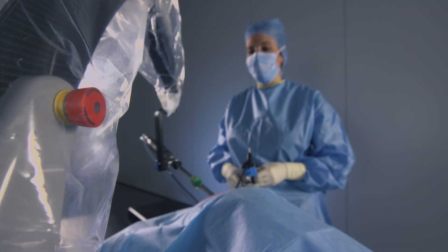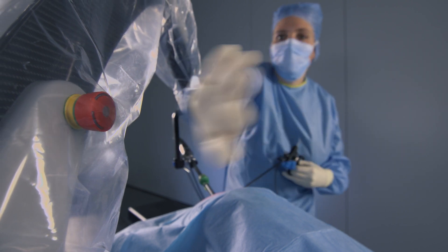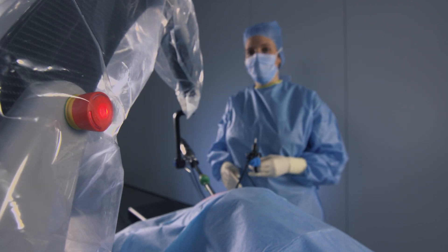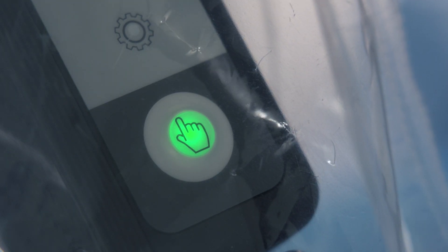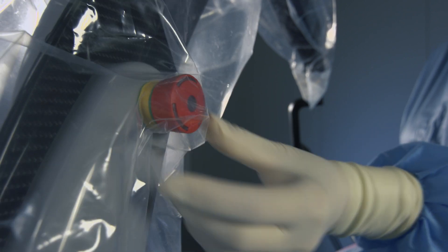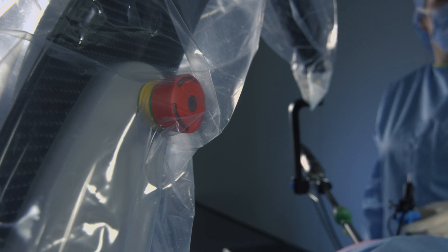The emergency stop button is on the side of the device. This can be pressed if there is unintended movement. The button will illuminate red and disable the joystick. However, you will be able to handle R-tip Solo manually with the control panel. To unlock the emergency stop, turn the switch clockwise. After an emergency stop, the trocar point must be set again.